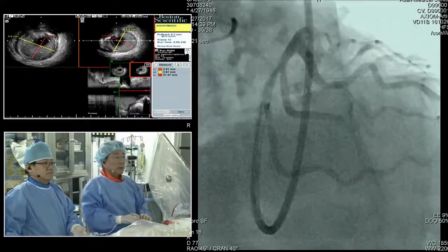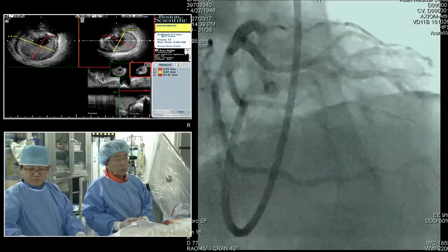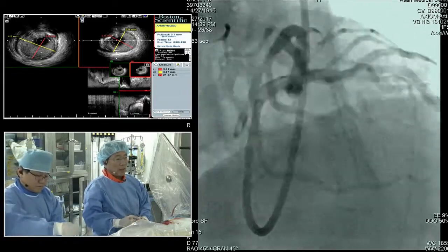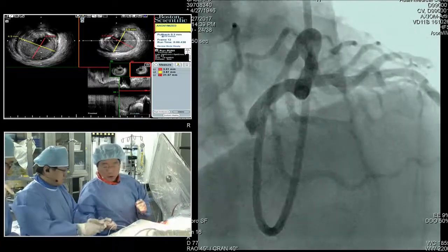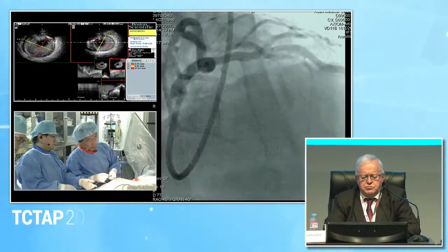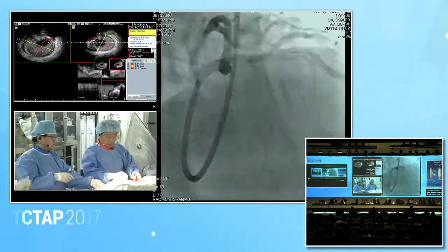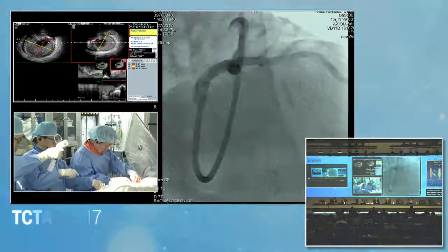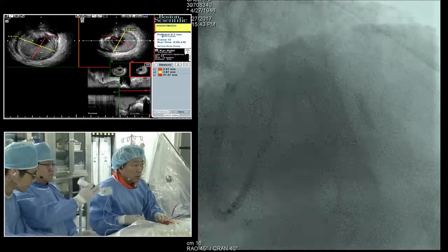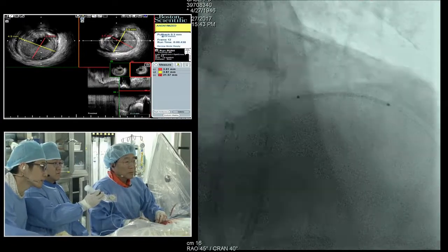Okay. We're very comfortable to do the procedures. Just stent for the diagonal branches, and separately balloon crush, and softly another stent to cover the main branches, and then we're going to finalize with the final kissing balloon inflations. In almost all cases, we have to consider, okay, test please.